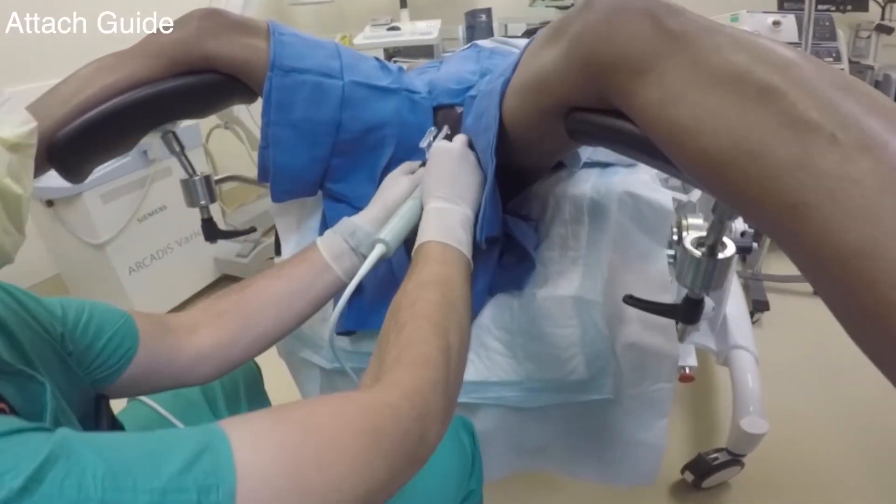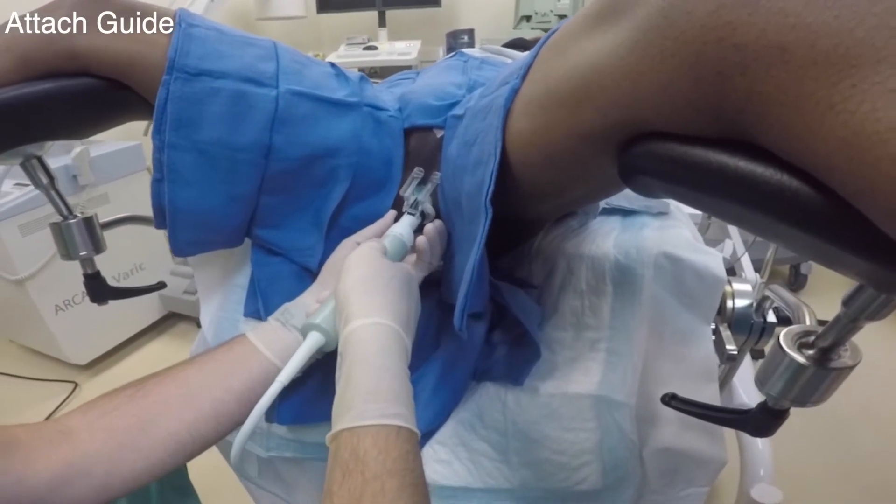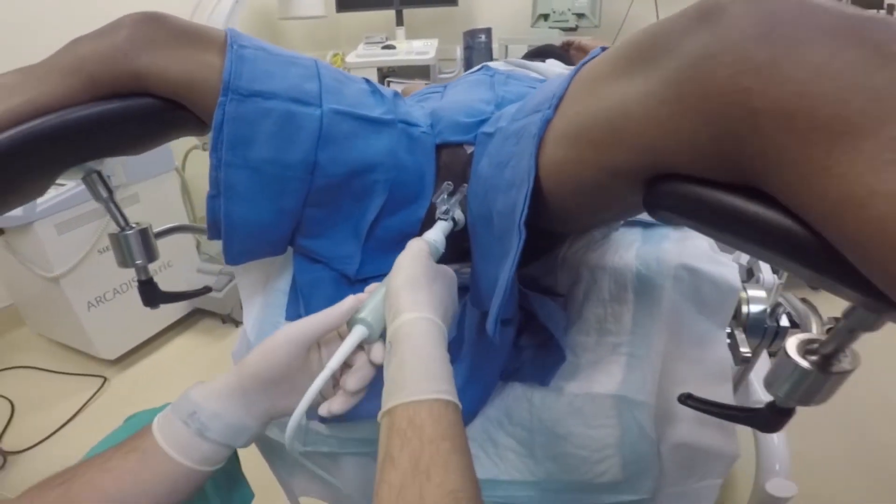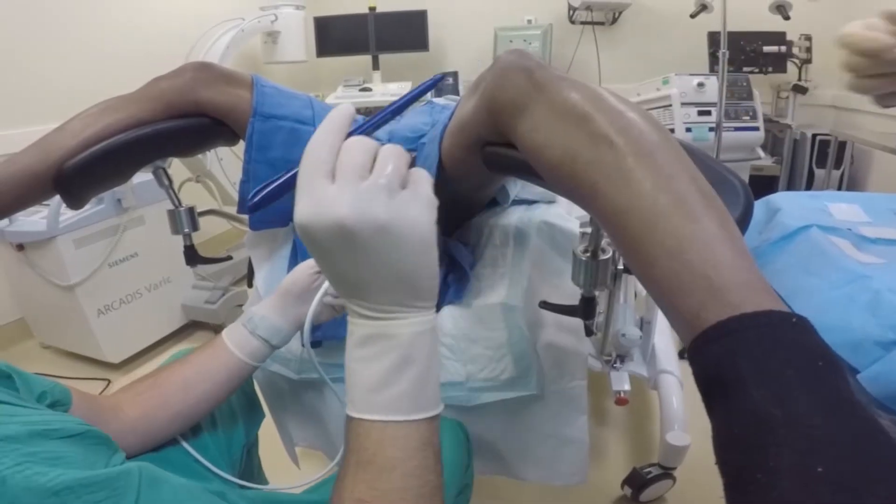Here, we clamped the sliding carriage onto the probe. It is important to ensure it is aligned with the 12 o'clock position on the ultrasound. Proper alignment will allow the user to visualize the needle going in and out.